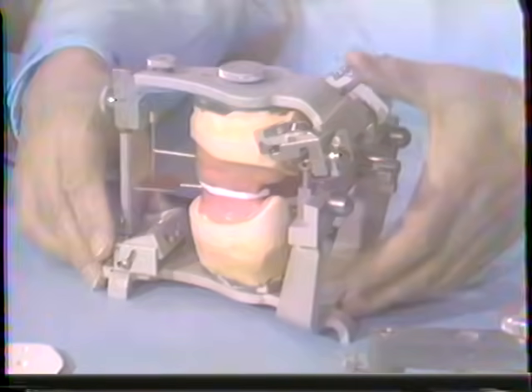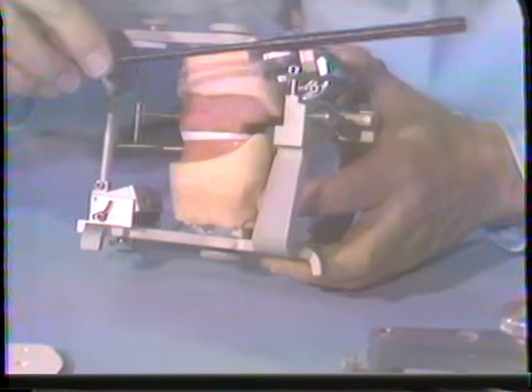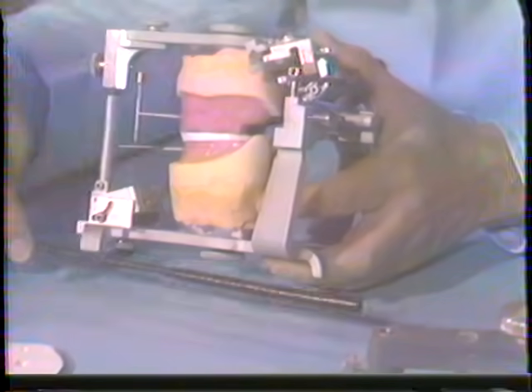Now, it's been found by a number of investigations and mathematical analyses that an arcon instrument simulates mandibular movement a bit more closely than the non-arcon type.